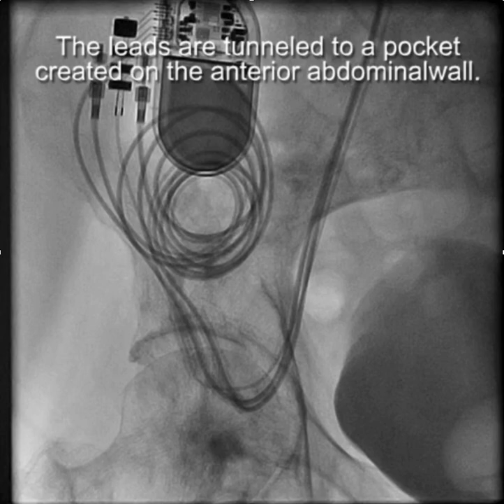This is how it can be done if there's no other choice. I'm told by the patients that it's well tolerated, despite my initial impression that it would be pretty uncomfortable. I think it's a far better option than sending a patient for an epicardial system.